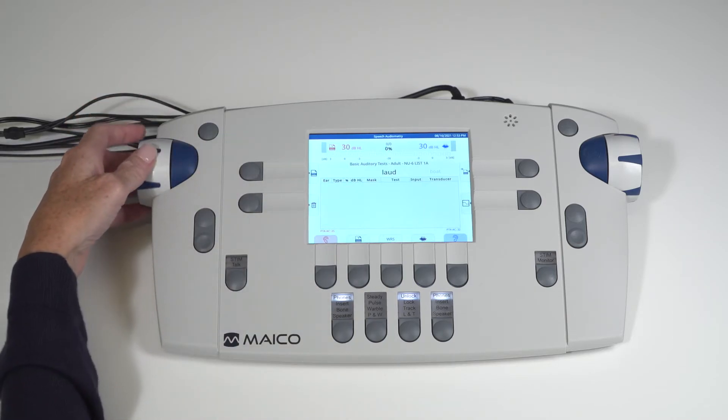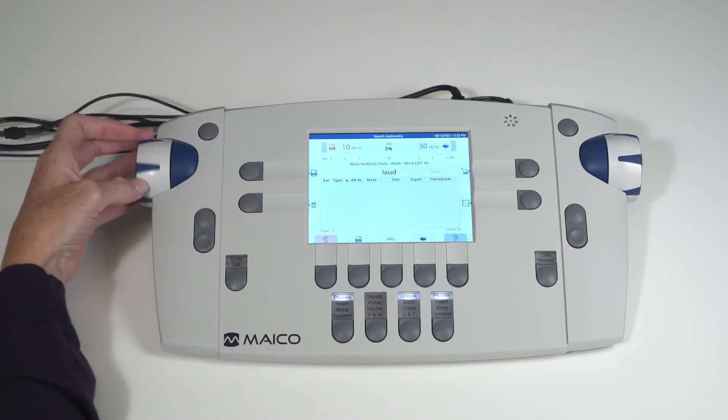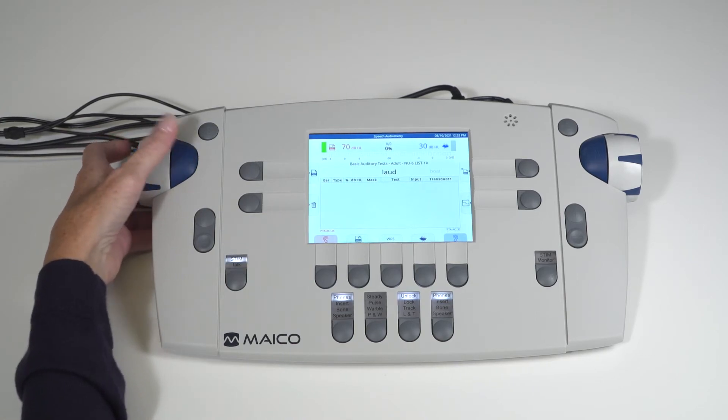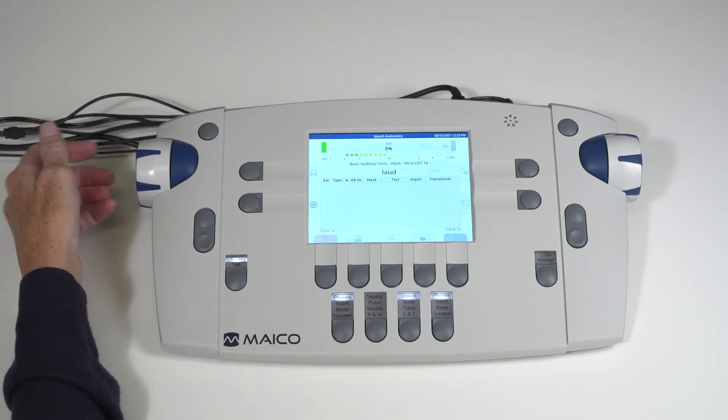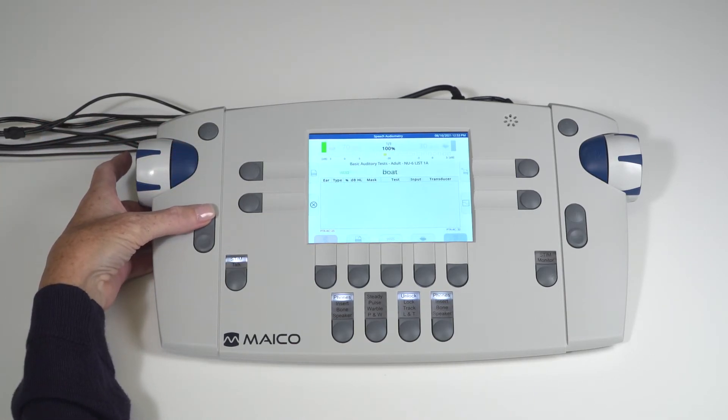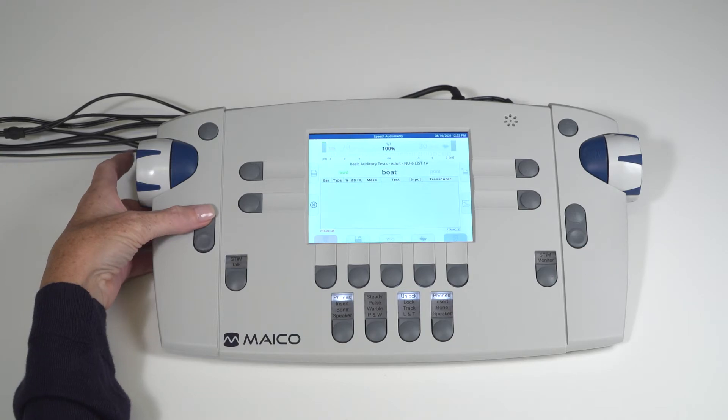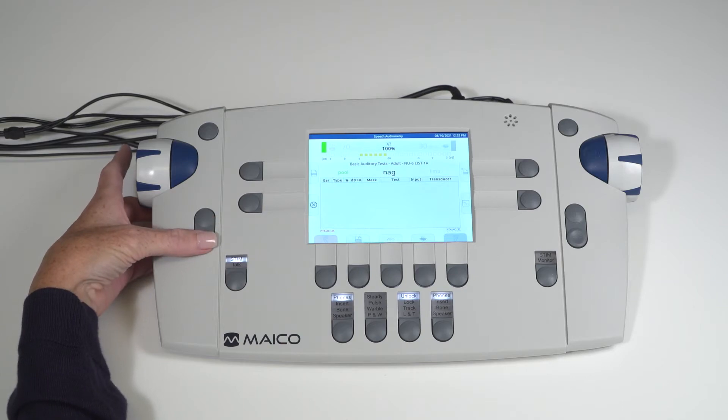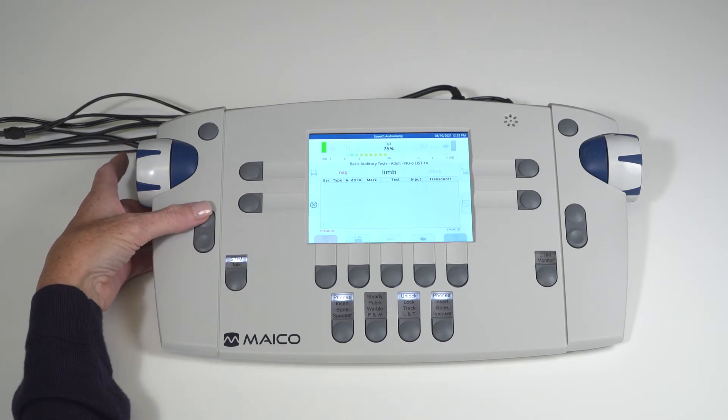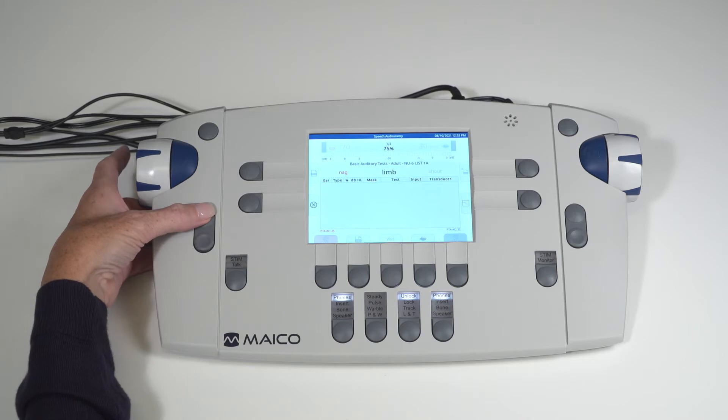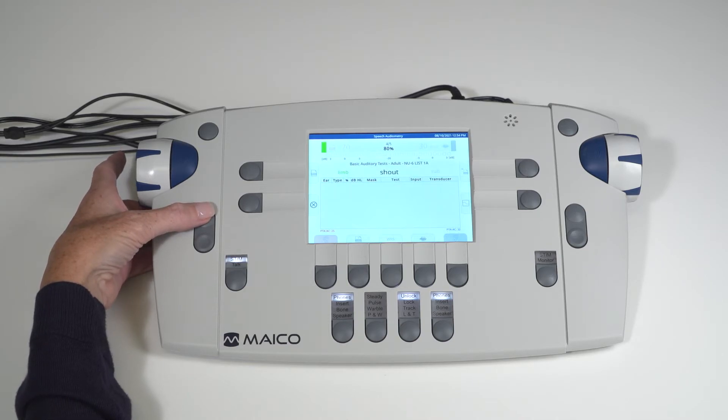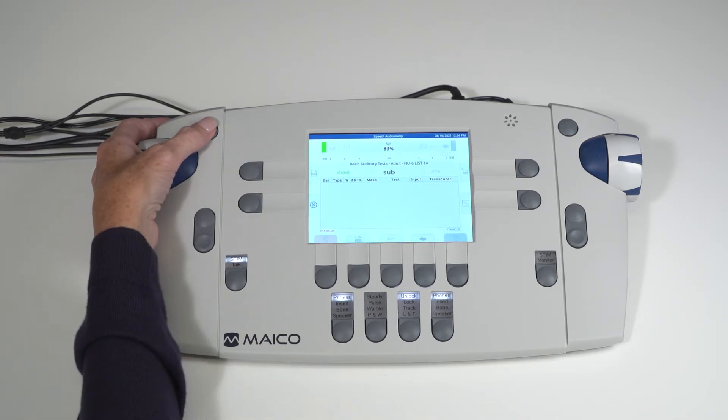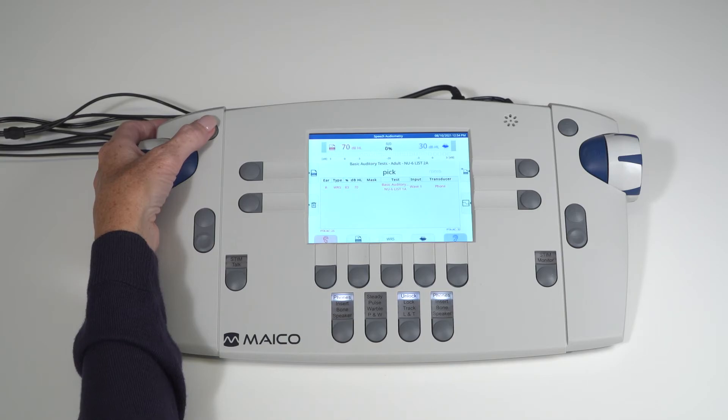For WRS scoring, set your level and press the present key to begin. The recorded words are presented to the patient. Score the responses correct or incorrect using the plus or minus keys. Press the S key to store the result.